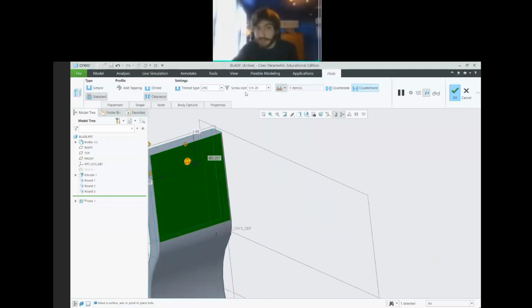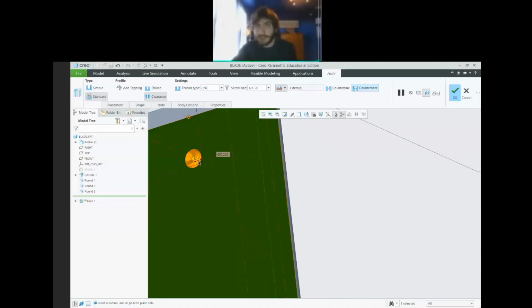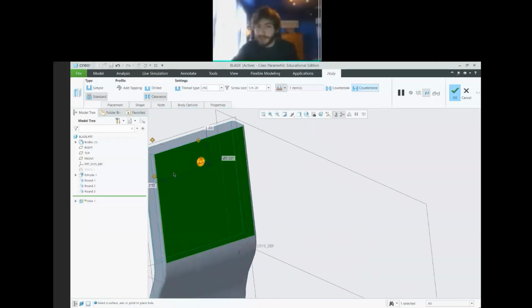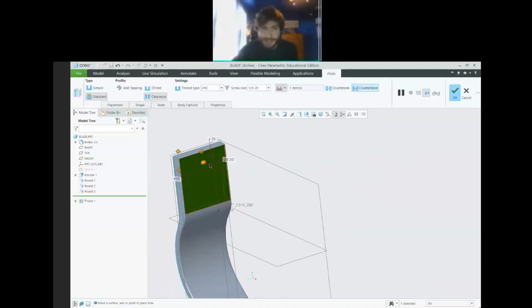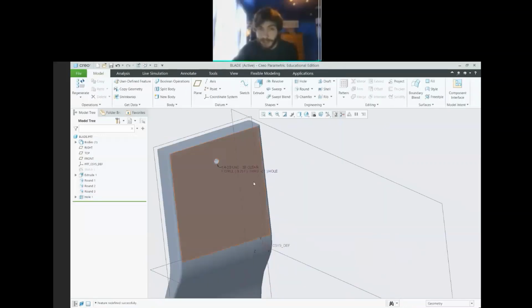And because it knows what bolt we picked, all of these things are set by default. Whereas normally we would have to go on the internet, find all of our tables, right, and deal with that. But all of these programs have the default threads built in because they're used all the time. Why not just have it in the database? All right, so that is what our hole looks like, right?